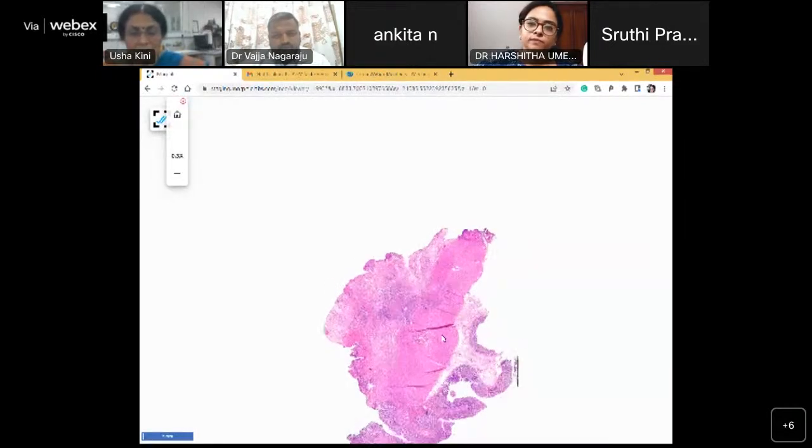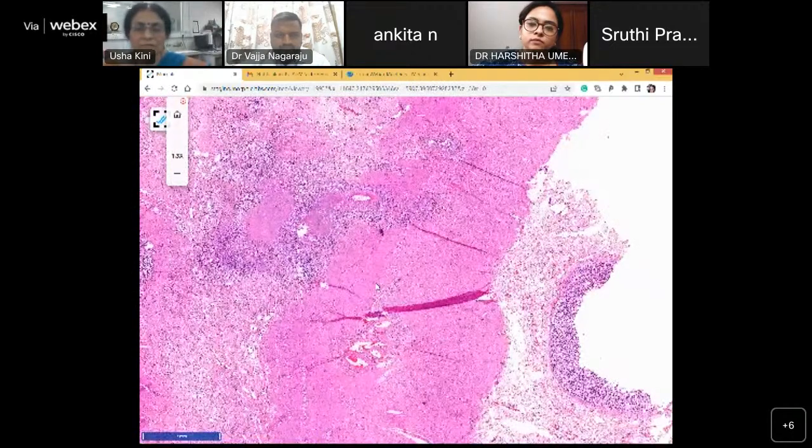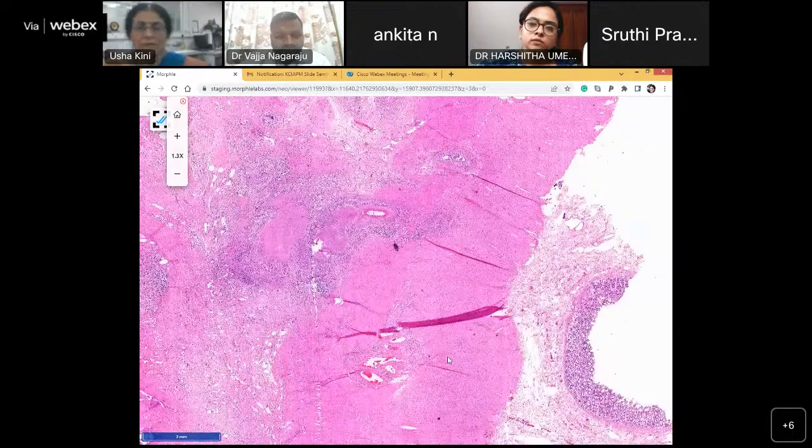Yes, ma'am. Down part. Okay, so if you go closer, here you have something which is curvilinear. What do you call this? You agree, Nagraju, that this is necrosis? Yes, madam. Why necrosis?